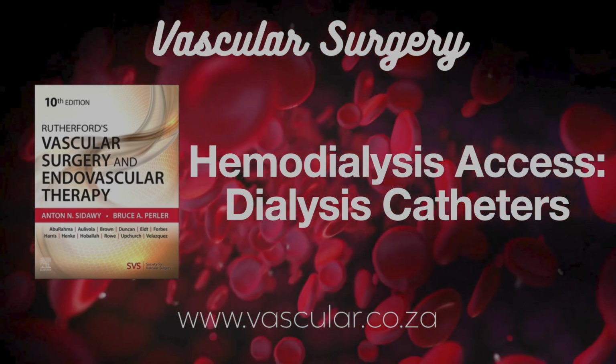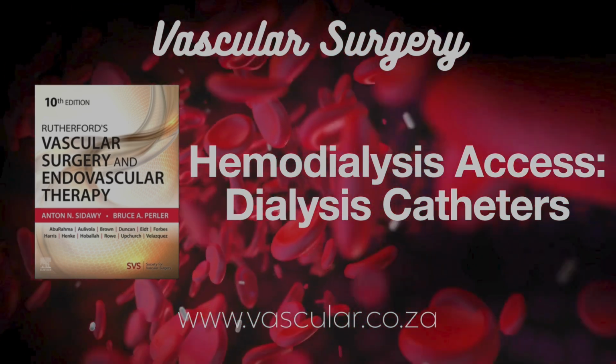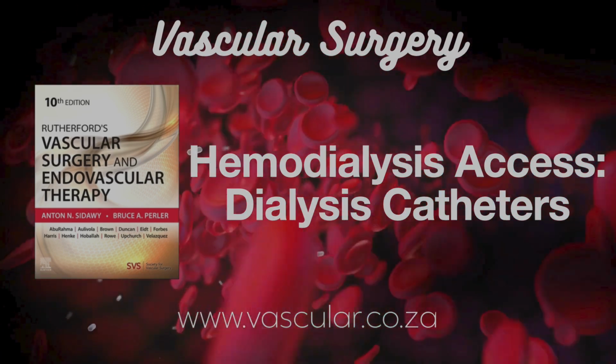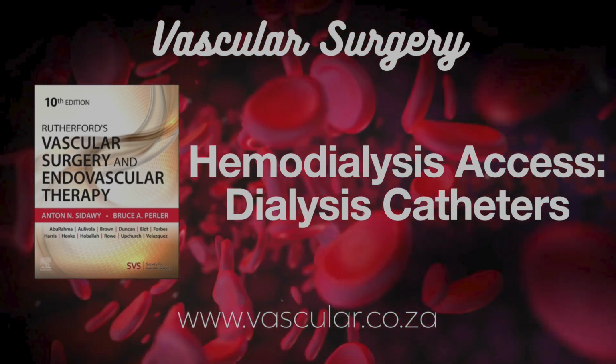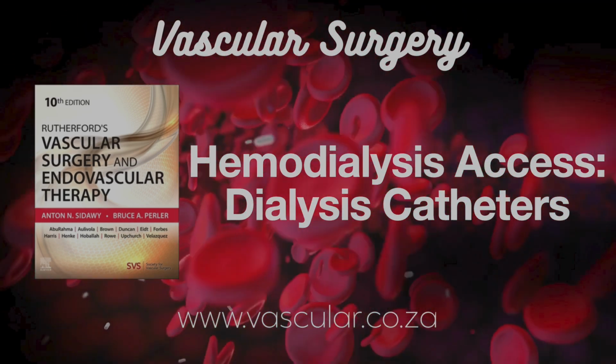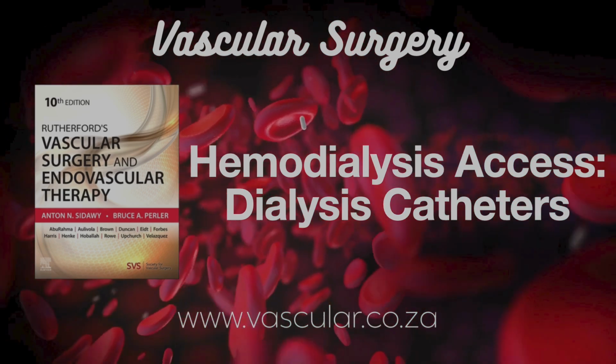Interesting. What if the usual neck veins just aren't usable? All blocked up? Yeah, that happens, unfortunately. When conventional sites are exhausted, we have to get creative. Unconventional sites like translumbar or transhepatic access might be considered. Translumbar. Transhepatic. Yeah, through the back and liver.